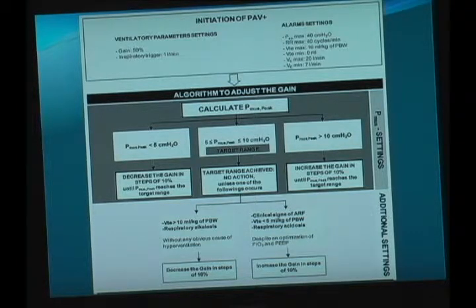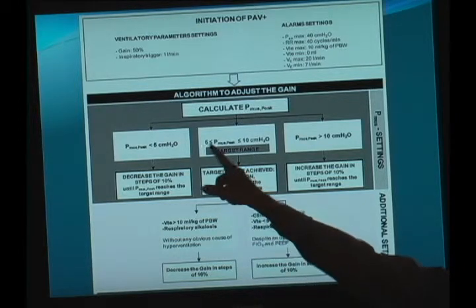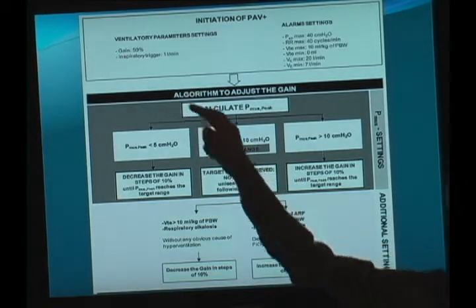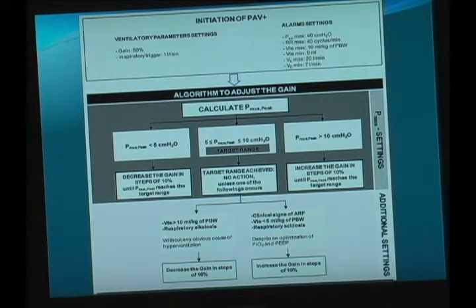Maybe it's because the patient is so weak that he is unable to make more than these 5 centimeters of pressure. So as much as the machine helps at 50%, the patient still remains stagnant and acidotic. So it's a suggestion that the pressure can be good, but the patient is unable to cope with that.